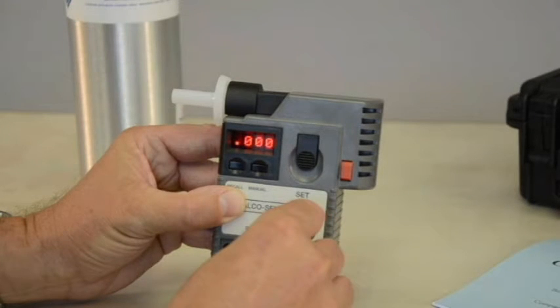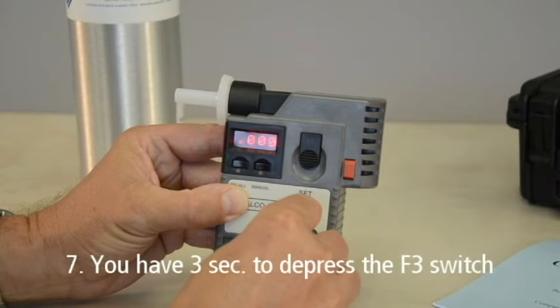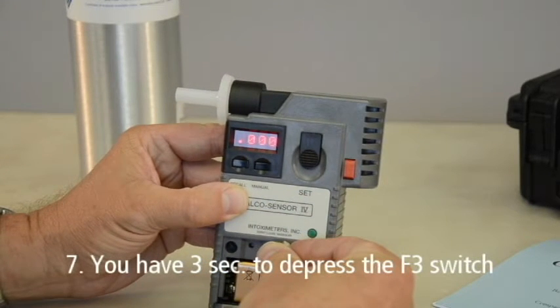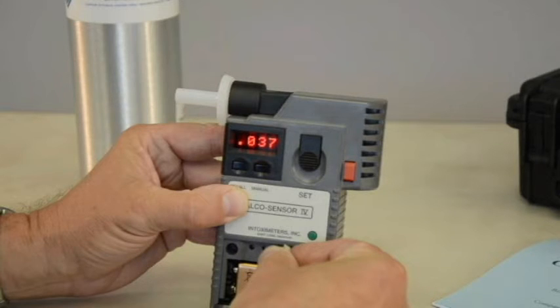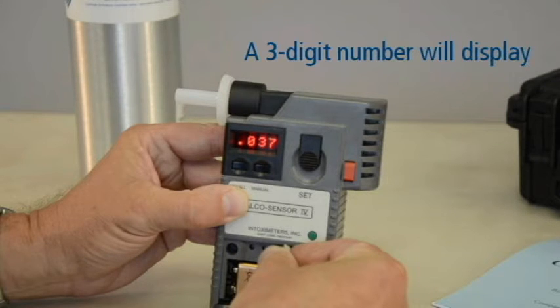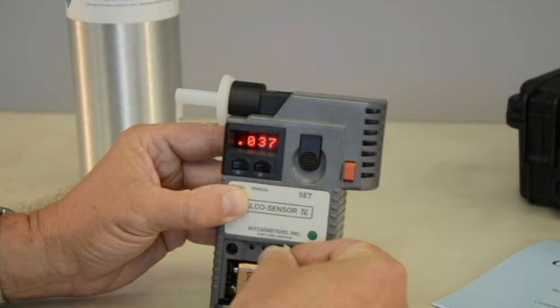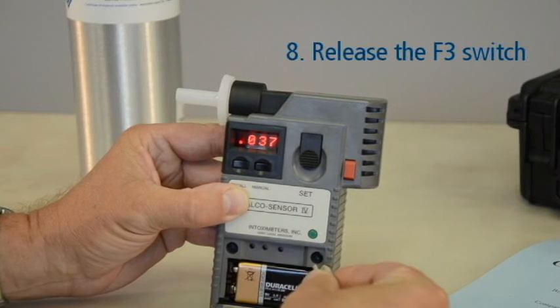As soon as the air blank result displays, you will have 3 seconds to depress the F3 switch, or the calibration procedure will be cancelled. Once the F3 switch has been depressed, a 3-digit number will display. This number is the value of the gas standard used from the last calibration performed. Release the F3 switch.